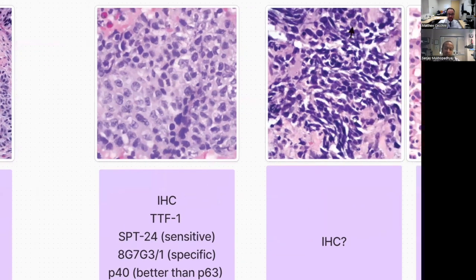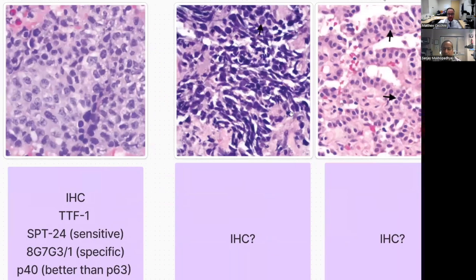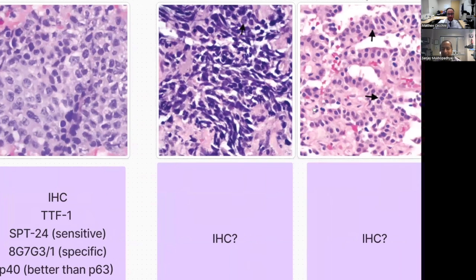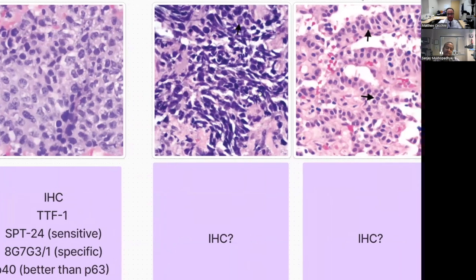Definitely. So I think that was good for non-small cell, and then let's move into where we're into the neuroendocrine world, right? So let's start with, we get a small biopsy of this kind of crushed, blue thing, that maybe you can see a little bit of granular nuclei and maybe some molding, but it's really crushed. What do you think about in this scenario?